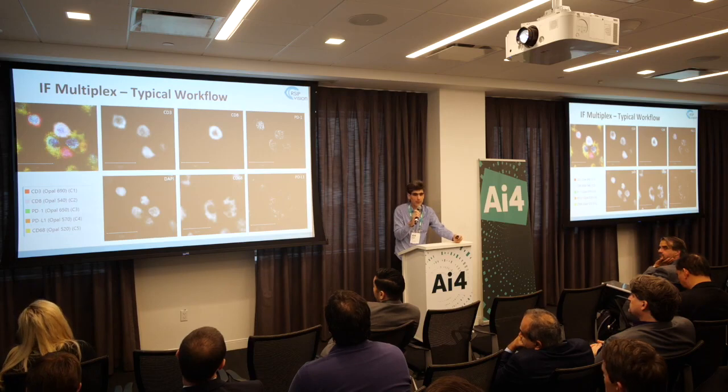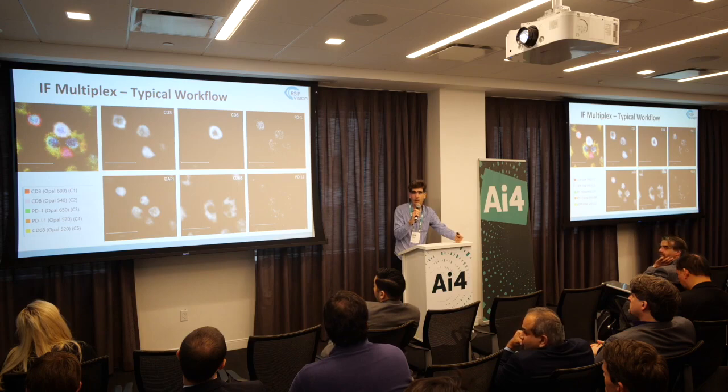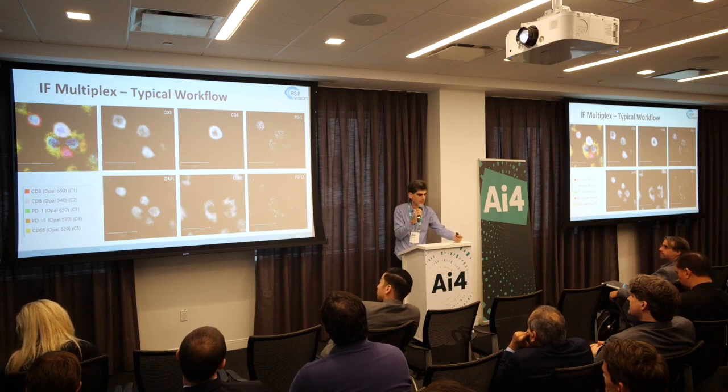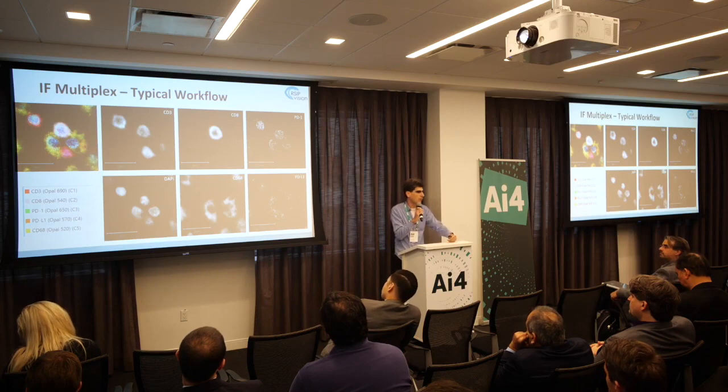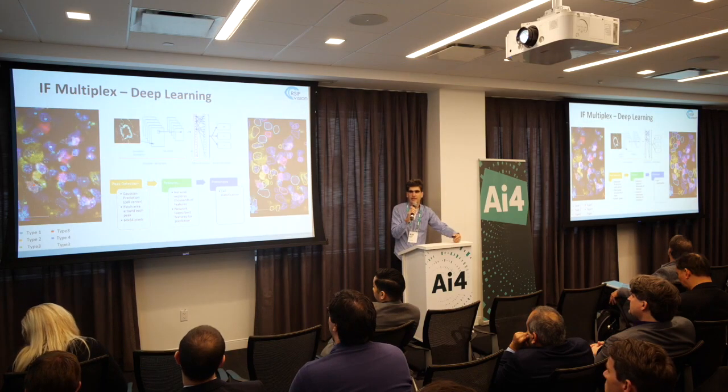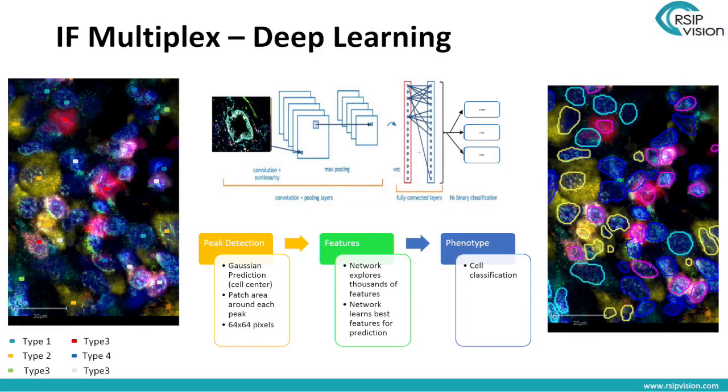Maybe you want to do better than that. You want to annotate it. It'll be easy to train your annotation team. In more subtle cases, they can still be annotated by a human, but rule-based systems are not going to work. And then maybe you'll need an expert to do more of the annotation themselves, clicking on each cell and selecting the proper cell type. Maybe you'll need more extensive training of your annotation team. Maybe you'll have more errors. You'll need to invest more human resources.